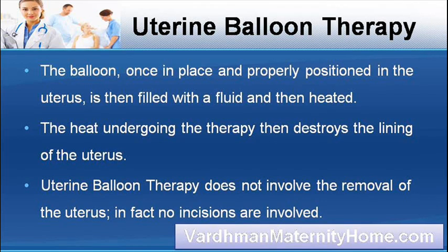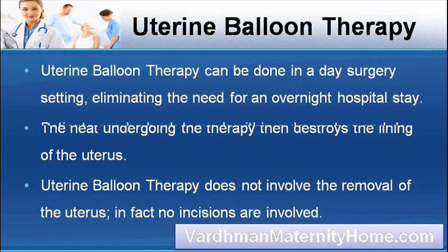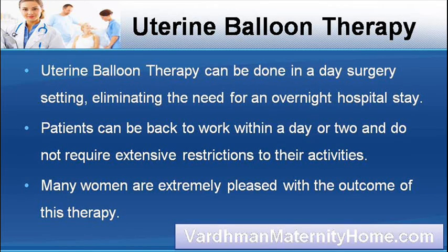Uterine balloon therapy does not involve the removal of the uterus, in fact no incisions are involved. It can be done in a day surgery setting, eliminating the need for an overnight hospital stay. Patients can be back to work within a day or two and do not require extensive restrictions to their activities. Many women are extremely pleased with the outcome of this therapy.